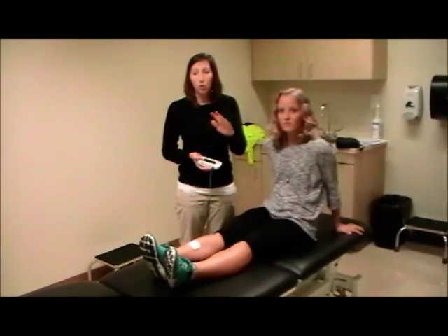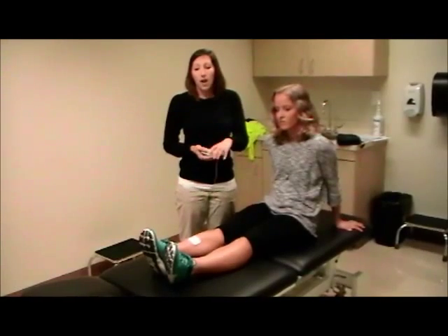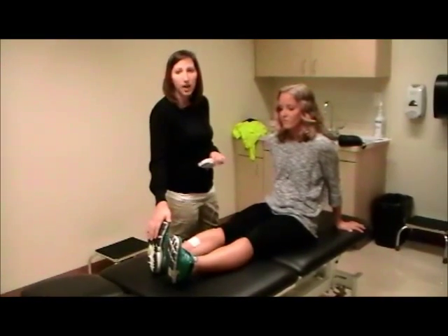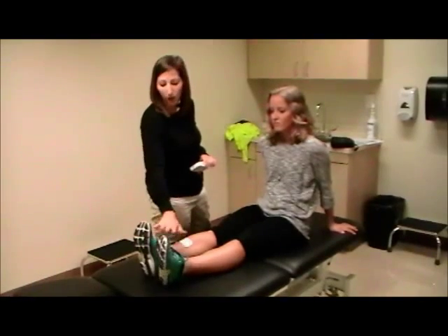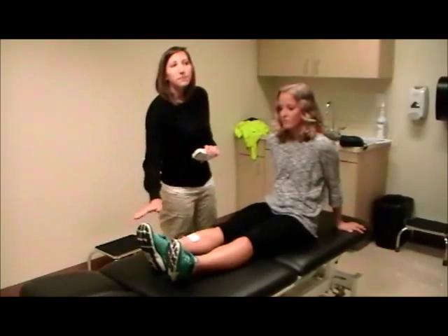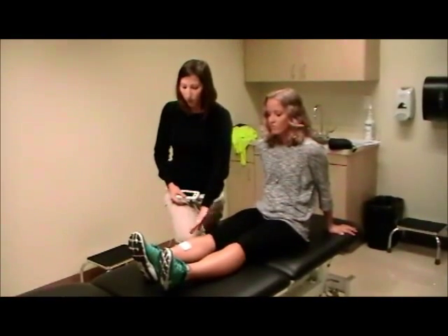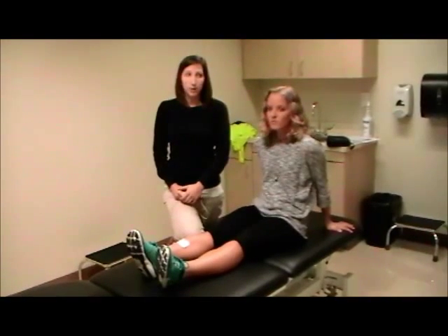According to the article, the patient should be with both legs extended. What you're going to ask them to do is dorsiflex the ankle when the cyclic NMES turns on, and then keep the other leg relaxed — dorsiflex when it turns on and relax when it turns off. The protocol uses 2x2 electrodes: one just below the fibula on the common peroneal nerve, and the other on the motor point for the anterior tibialis.